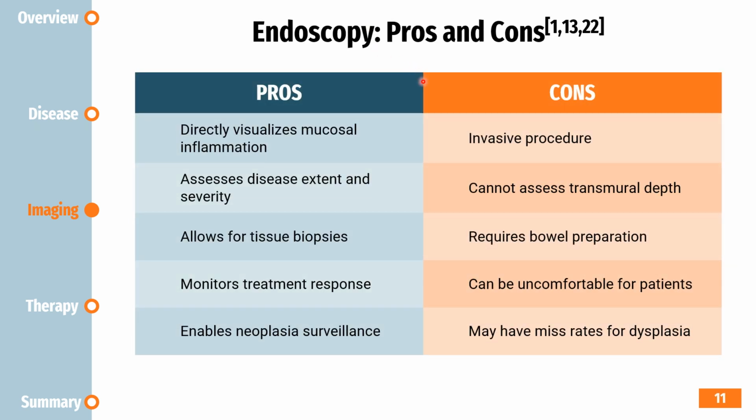So endoscopy is a useful tool because it lets doctors see inflammation in the digestive tract directly, check how severe and widespread a disease is, take tissue samples for testing, monitor how well treatments are working, and look for early signs of cancer. However, it is a really invasive procedure that requires cleaning out the bowel beforehand, can be uncomfortable for patients, and doesn't show how deep the disease goes beyond the intestinal wall. It is also not perfect and can sometimes miss dysplasia or abnormal cells.